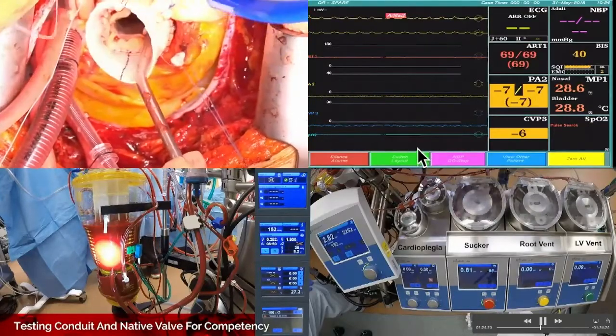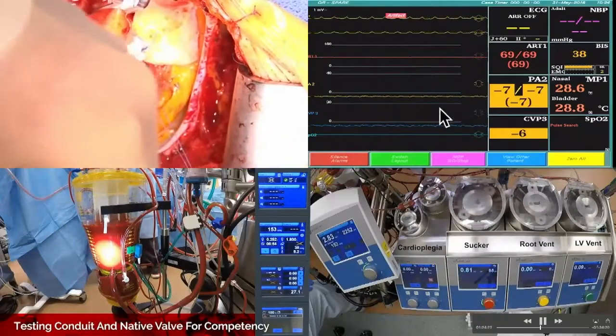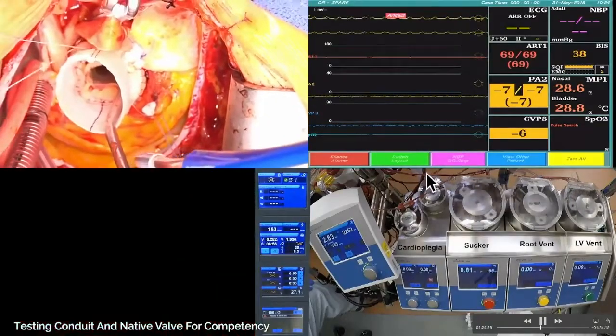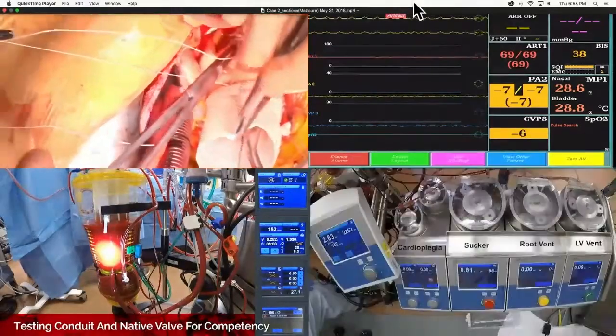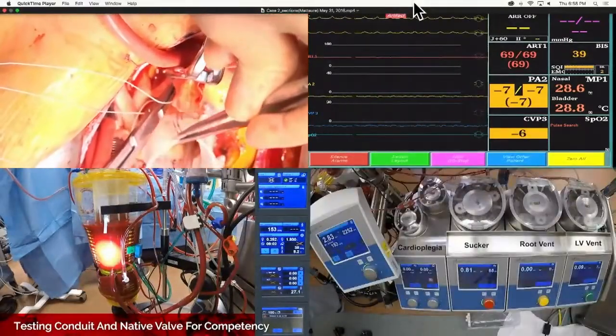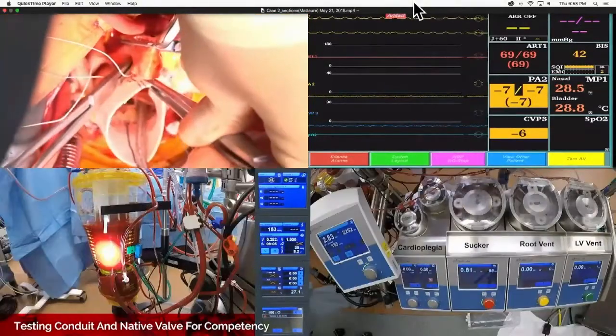Well, if the surgeon's not yelling at you, it's probably not. Right, exactly. That's true. But still, nevertheless, some surgeons, you'd be surprised. Now watch him do the loop. So you see the artifact. Now let's watch him do it. So they see that. I told you this works.